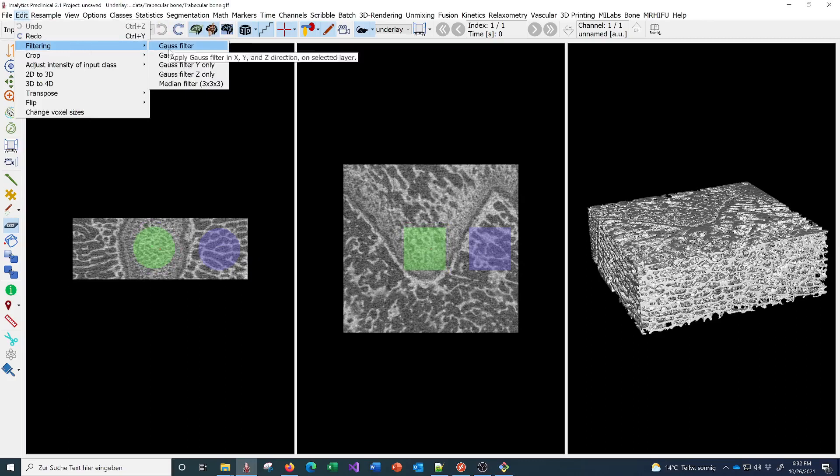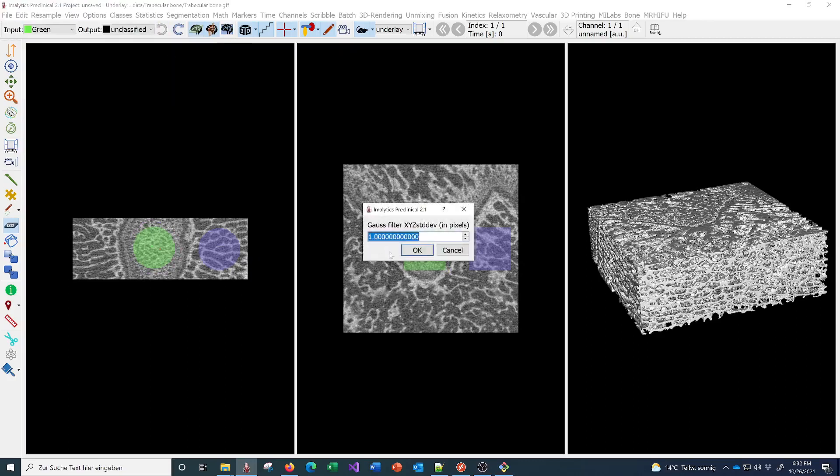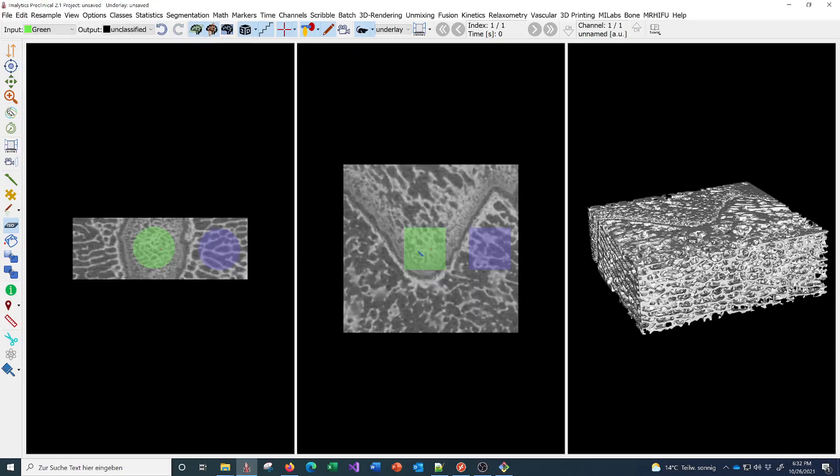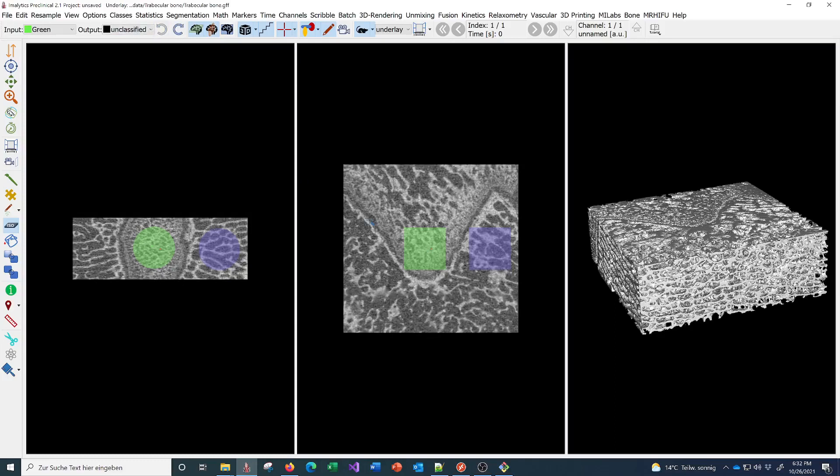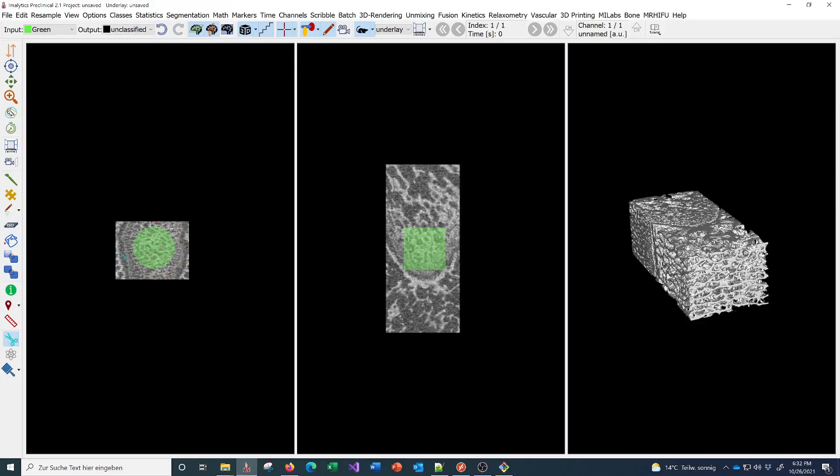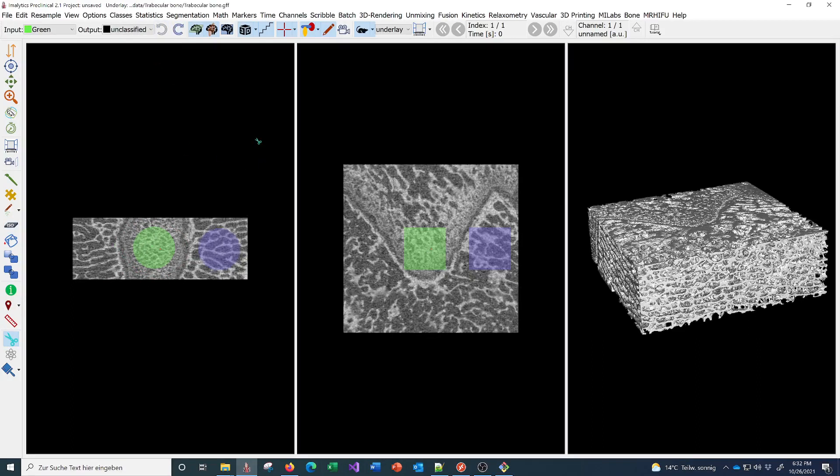You can also do image operations. You can apply a Gaussian filter, for example, to smooth the dataset. You can also undo that. You can perform cropping here if you want to crop to a region like that.